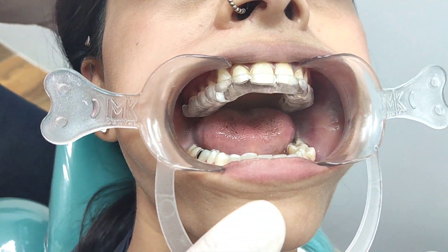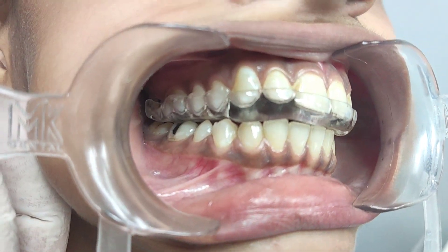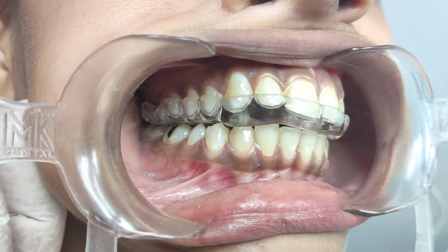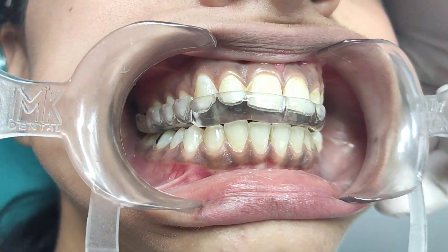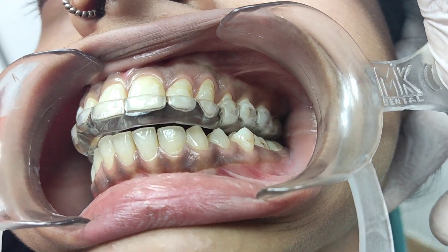If you can close down please — bite down. That's how close we come to the final position when we use a CAD CAM splint.